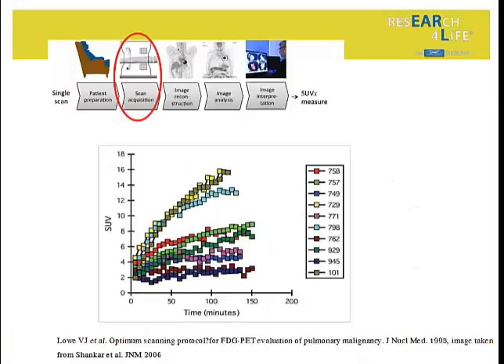So, scan acquisition: you can see how SUV can change depending on the time at which the patient is scanned. When you scan the patient at the beginning, right after injection, or really late, SUV may change really widely. There are some studies talking about pulmonary malignant disease.